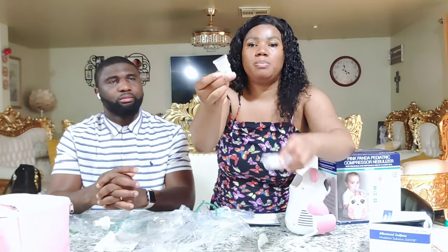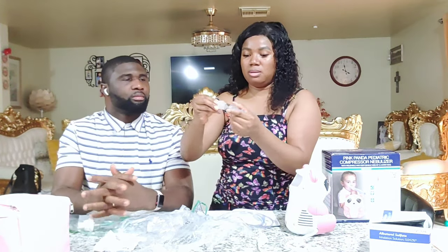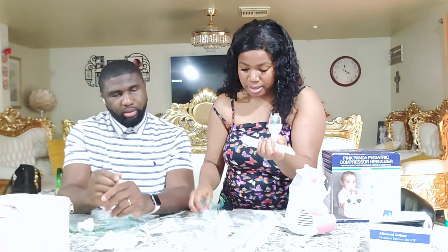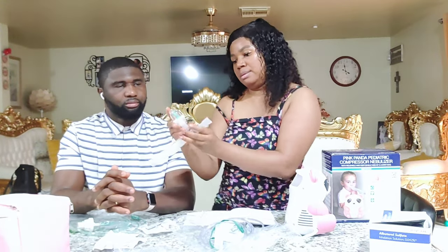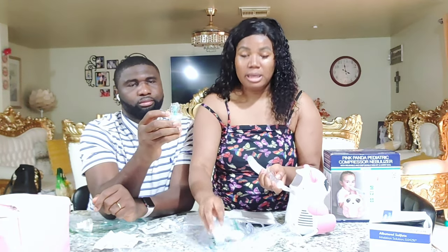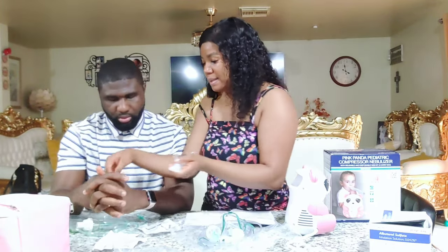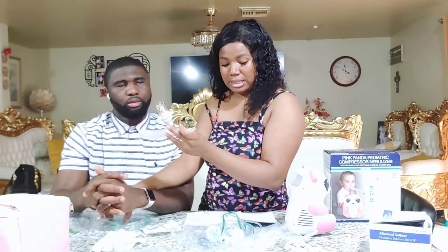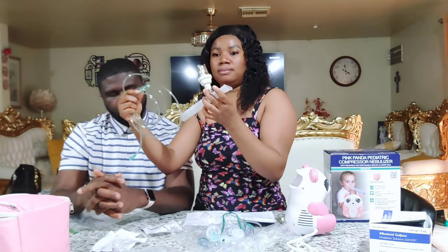Okay. So this is usually the mouthpiece if it was a grown person or a bigger kid. This has its own mouthpiece. That's why it's separate. I don't want to combine them. So they come in separate bags. This is where I put your medication. The one with the green thing came with the mask. So let's keep that separate. And the one with the beige color came on one side, and I think that came with the green tube. So where is this tube going in?